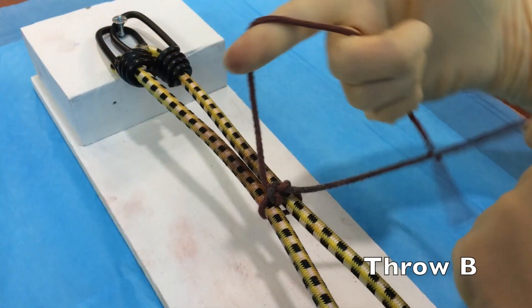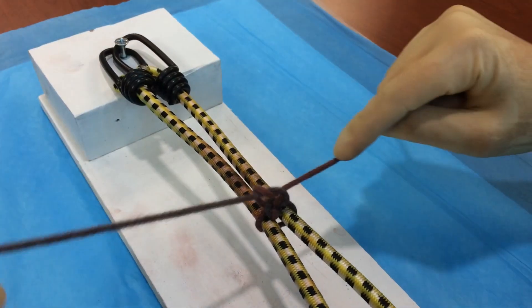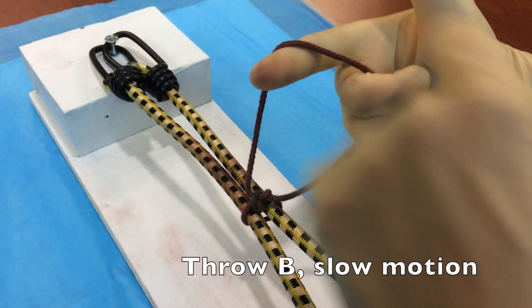Now let's talk about throw B. For throw B, we're going to put our right hand in what's called the pistol position. That's full speed. Let's take a look at it again in slow motion.